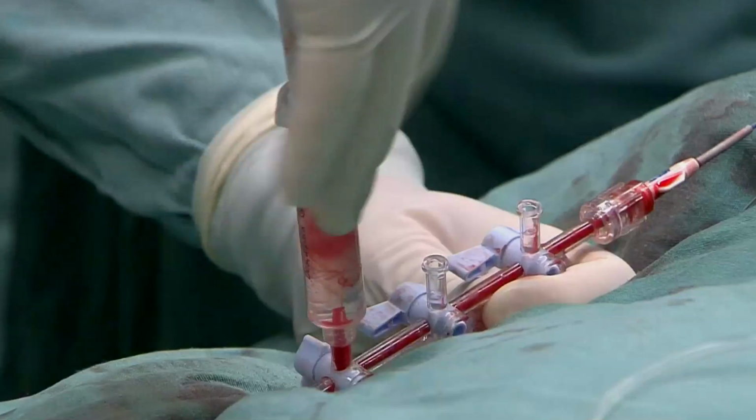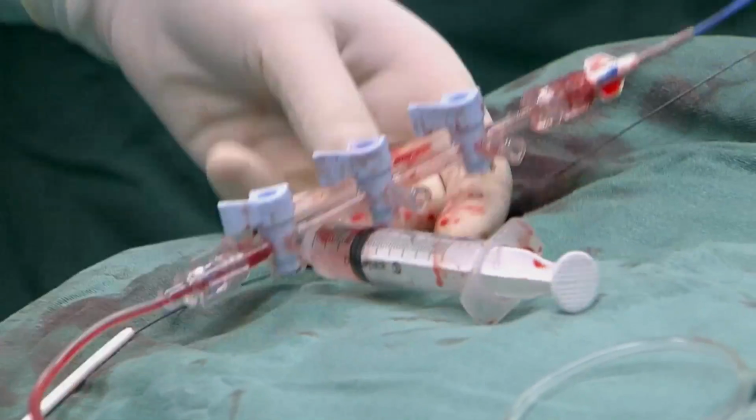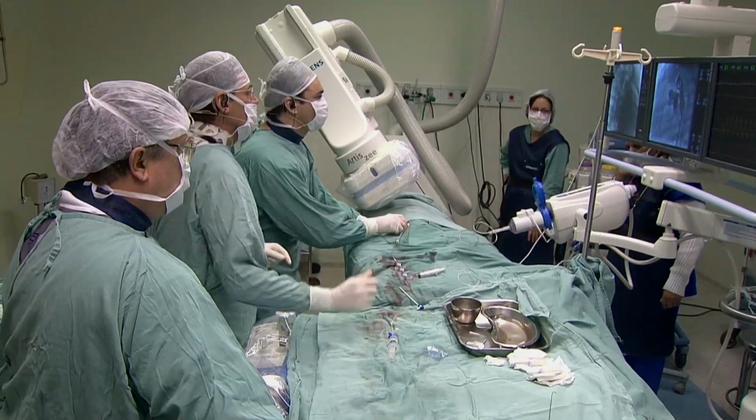Muscular VSD device. Yeah, that's what I was suggesting to you, Carlos. Would you consider using a muscular VSD occluder in this case? Because you have a tubular duct with no constriction, maybe more stable, maybe safer, at least theoretically. I agree, Mario. What size of muscular VSD device would you use, Mario? Well, probably the 8 millimeter.